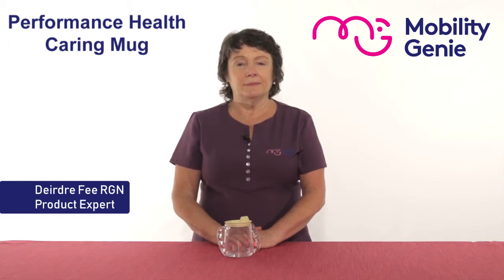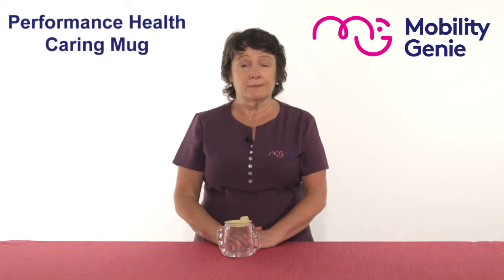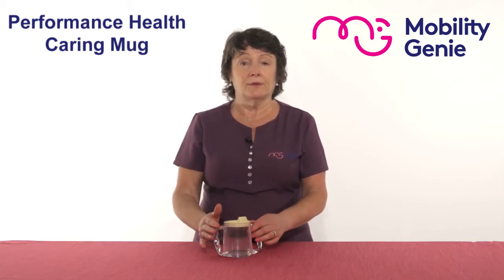Deirdre from Mobility Genie. At Mobility Genie we are constantly being asked for feeding cups. For one reason or another, a person who can't handle a normal cup or glass would need something that they will feel safe with.